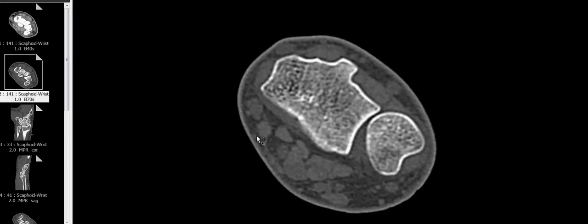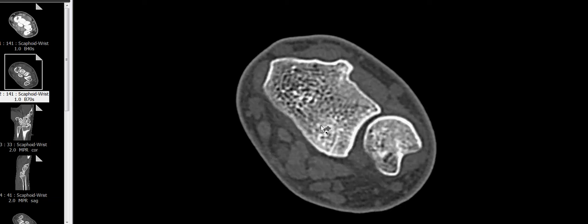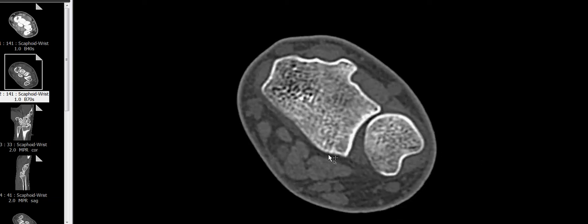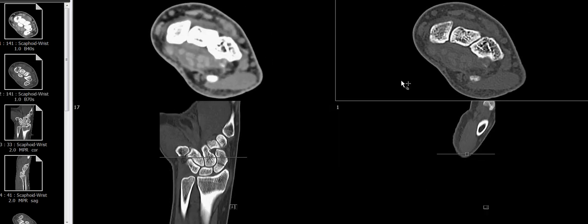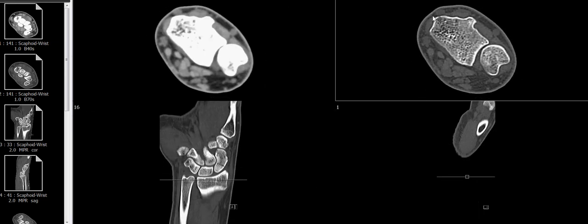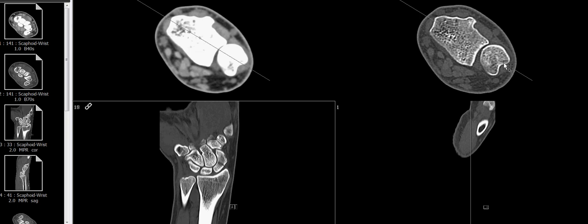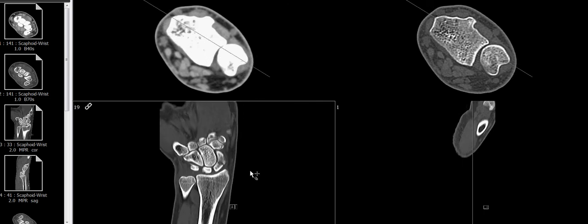On the axial CT you can see that there's an angle to the wrist — it's not straight up and down. So rather than obtaining planes that are sagittal and coronal in the standard orientation, the technologist appropriately went to the distal radial ulnar joint and saw that the axis along the distal radial ulnar joint is angled. So the MPRs — the multiplanar reformats — were made with the coronals and sagittals perpendicular to that axis.